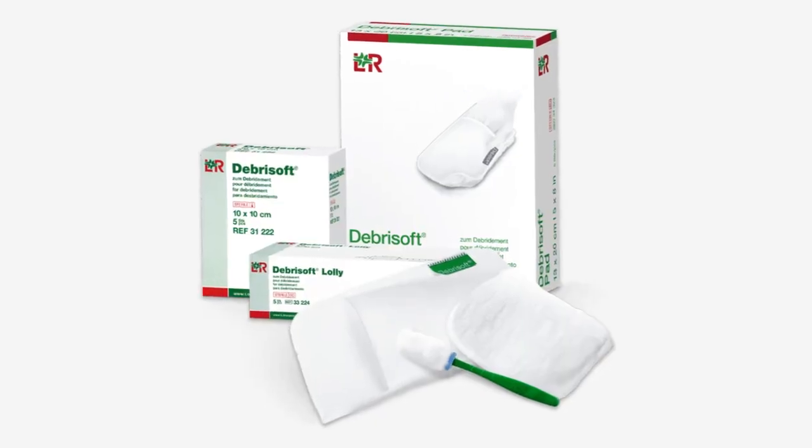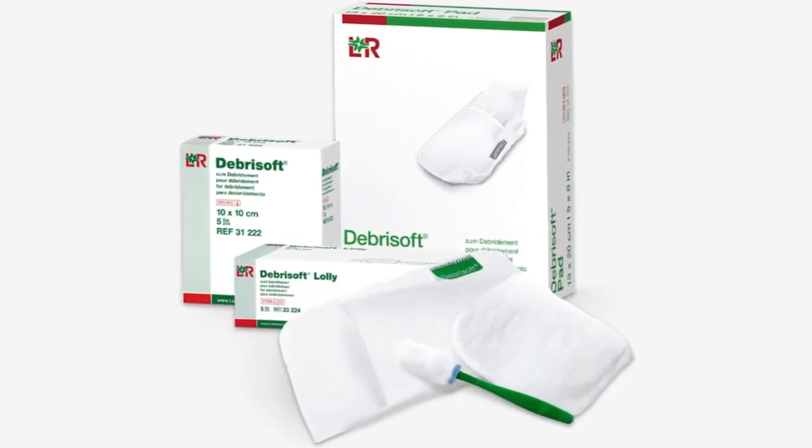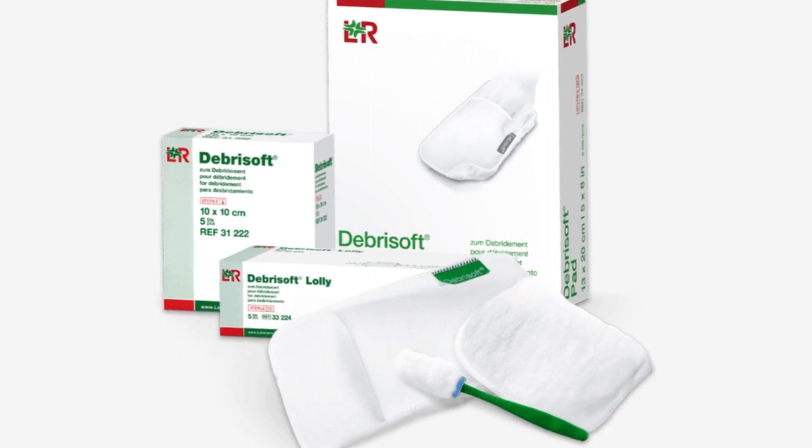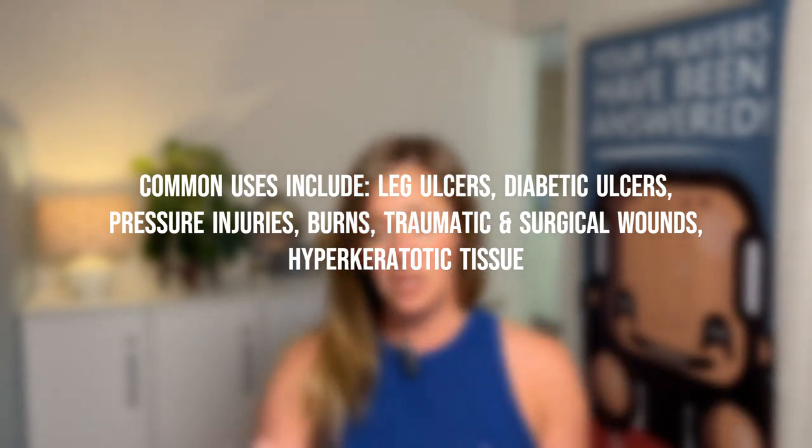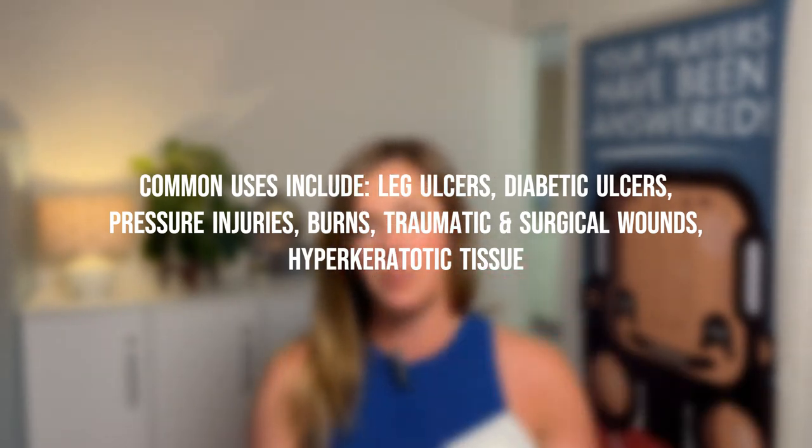This product is called DebraSoft, and as it implies, it is a tool that can remove debris, and it's soft. So we're looking at two pads here — one in a 4x4 and a 5x8. The 4x4 will be for a smaller ulcer wound you might have on any part of your body, while the 5x8 will be for a much larger area, say some kind of plaque on your leg, or just if you needed the extra space for some real good cleaning.